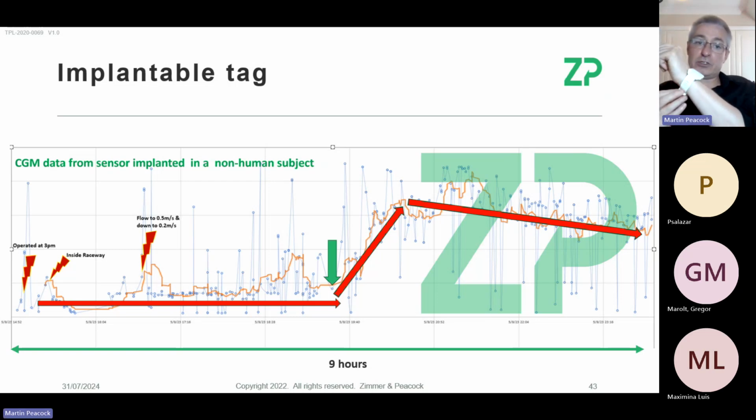And if I do this, my data is going to have that kind of artifact in it. Now, these kinds of artifacts have what we call a very fast transient, so you can appreciate that you can filter that kind of stuff. But the raw data can be very noisy. I think people think very much about the sensor and the electronics, but most people don't get to the raw data, because it's such a lift. Just to put this watch on my wrist has already had $20 million invested in it. It's such a lift that most people don't get to this point.